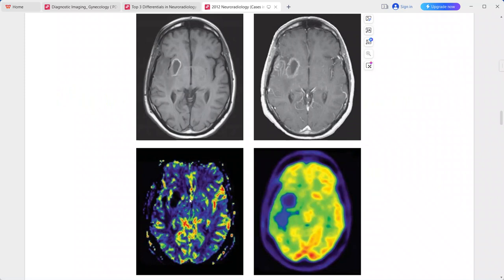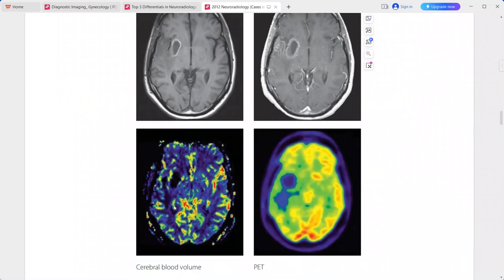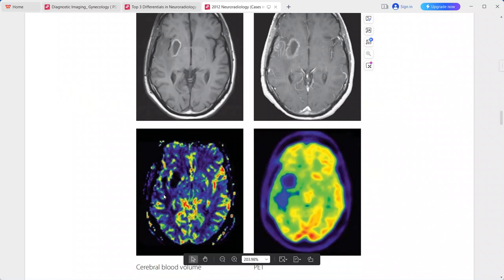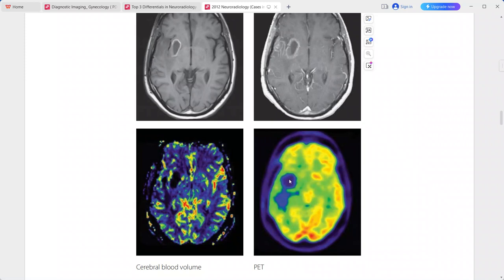The MR perfusion weighted images show corresponding decreased cerebral blood volume. The FDG PET scan reveals corresponding hypometabolism. Decreased cerebral blood volume along with hypometabolism on FDG PET scan is a typical imaging presentation of radiation necrosis.